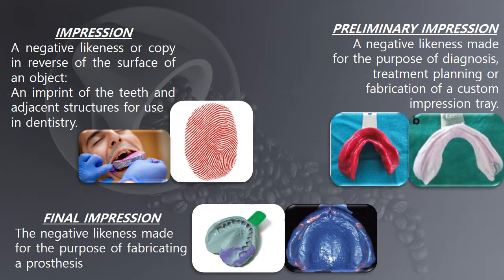In most situations, we need to have a live model in our hand for the purpose of diagnosis, the treatment plan, or the fabrication of the prostheses. To gain the live model, we need to perform one clinical procedure that is called the impression procedure. For that, we need to understand the meaning of impression.